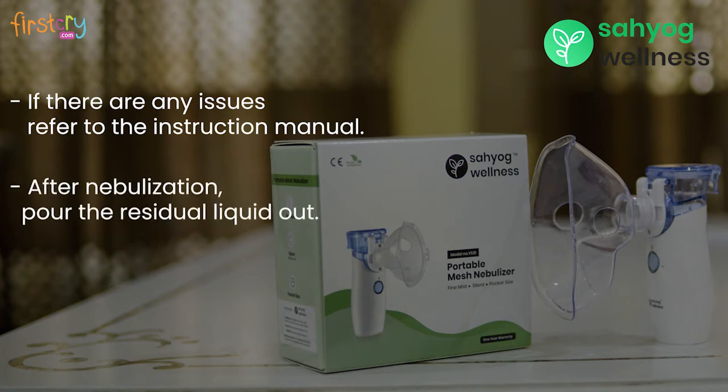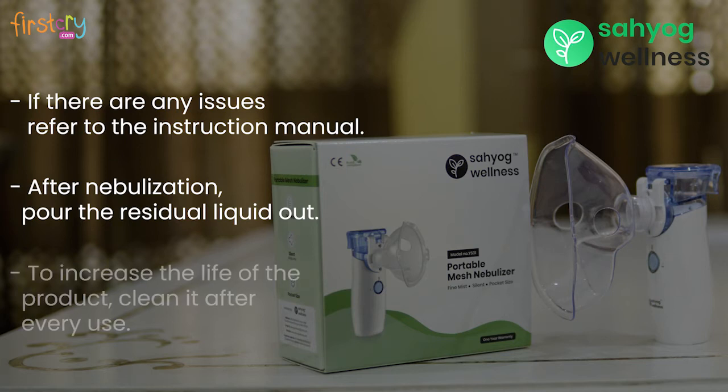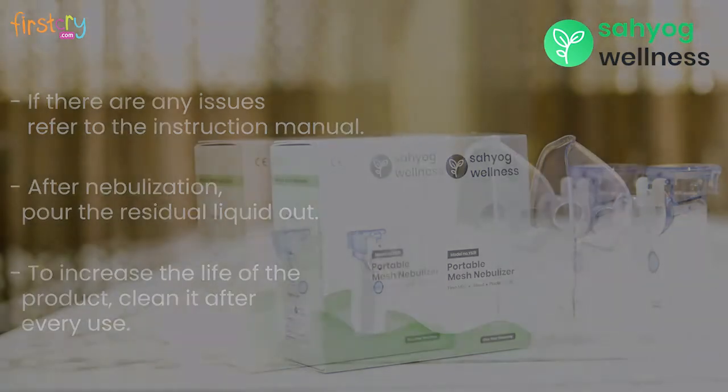After nebulization, open the chamber and pour the residual liquid out. Always clean the machine after use — it will also increase the life of the product.